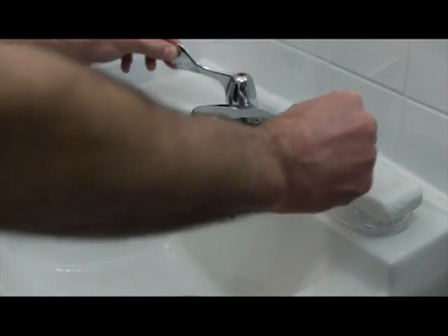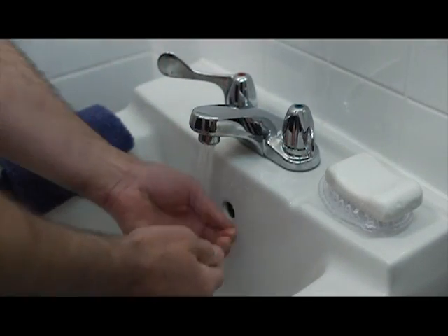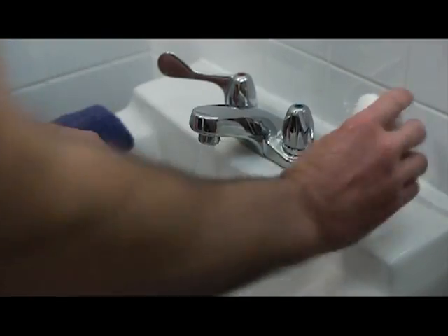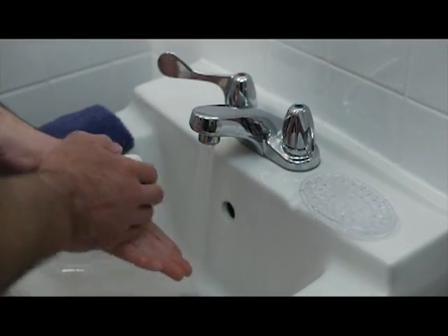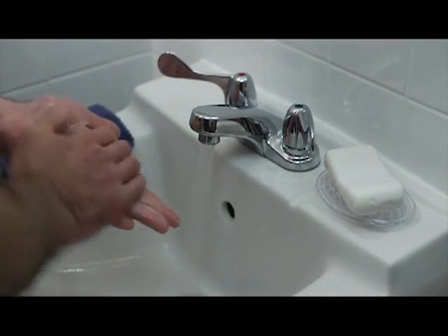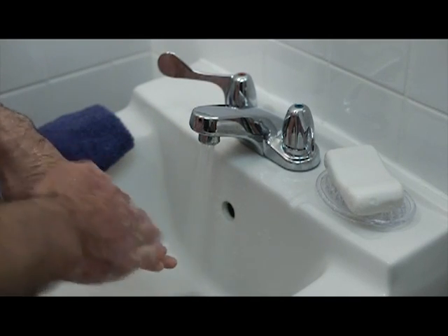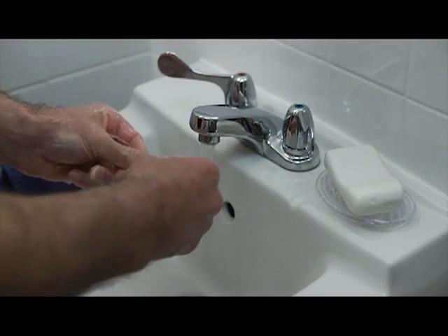Remember to always wash your hands before and after handling your ostomy appliances. Wet your hands with clean running water, warm or cold, and apply soap. Rub your hands together to make a lather and scrub them well. Be sure to scrub the backs of your hands, between your fingers, and under your nails.